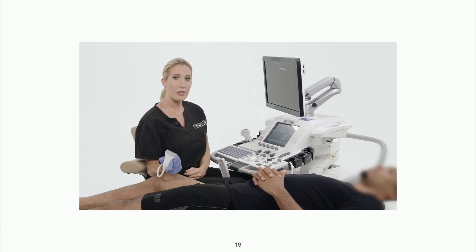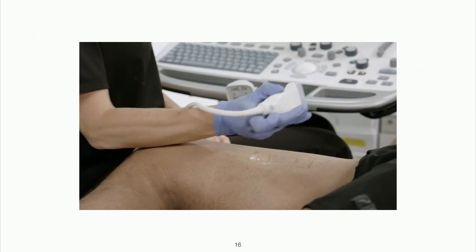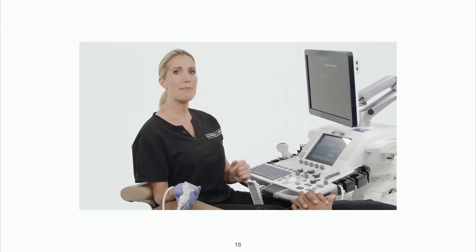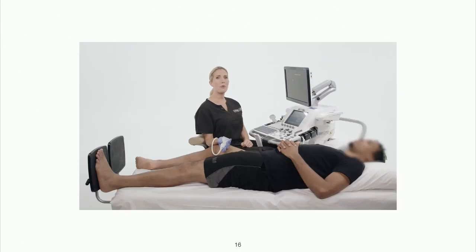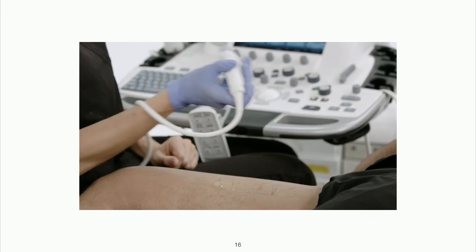The target vessel that we are scanning should be around the same height as your elbow, with the forearm parallel to the floor. This is why we raise the patient's bed when setting up our ultrasound environment. Furthermore, your arms should have a solid base of support. Holding your arm in the air for the entire part of the examination is not ergonomically viable.